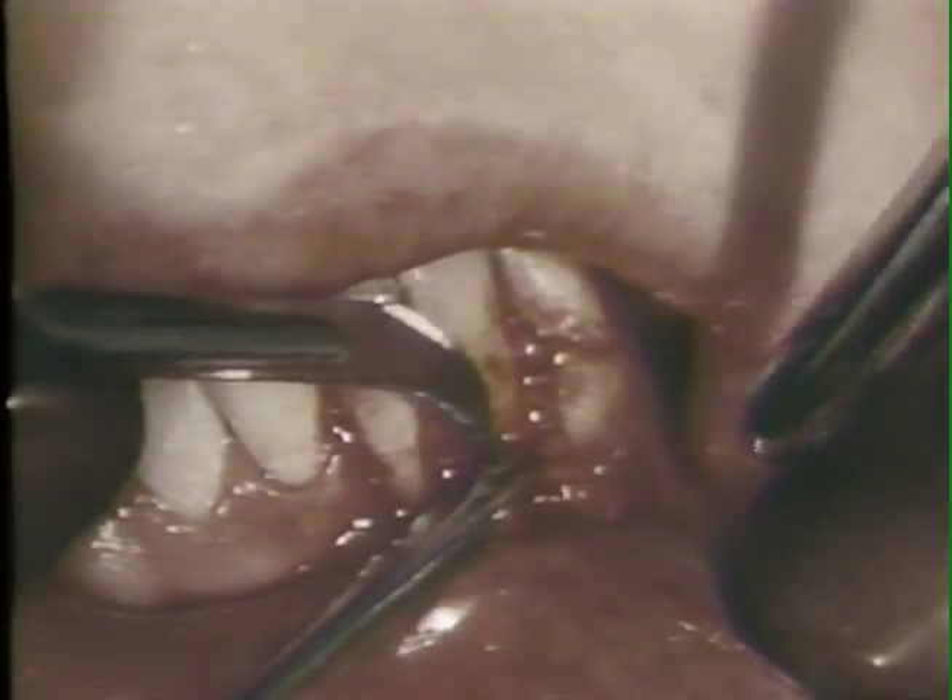The flap is dissected loose from the underlying periosteum with a barred Parker number 12B blade. The flap is gently deflected from the line of incision with a blunt instrument to facilitate dissection from the periosteum with minimal trauma to the flap. The dissection is extended through the zone of attached gingiva into the alveolar mucosa. When the flap is reflected, the periosteum on the surface of the bone is visible.